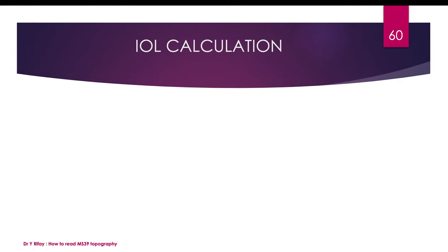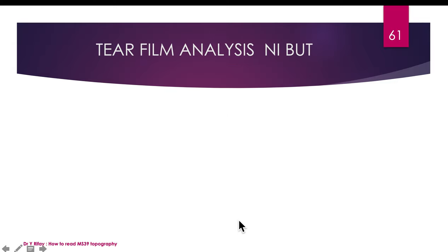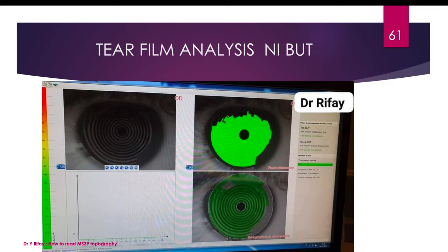It is helpful for IOL calculations. We should provide the axial length, and then the device will give us the power of the lens. It is helpful in dry eye, and it will measure the non-invasive breakup time. It is very helpful also in refractive surgery to avoid cases of dry eye.